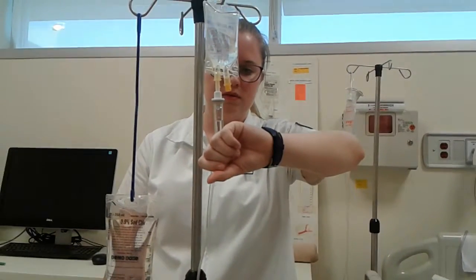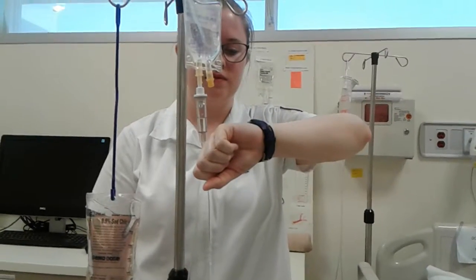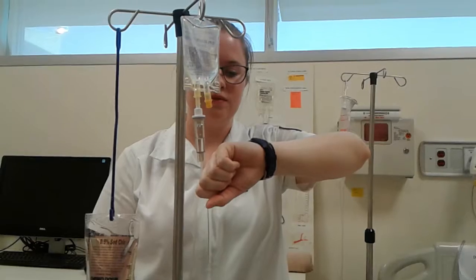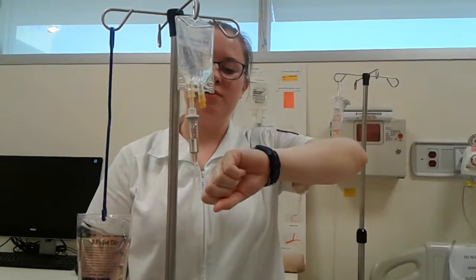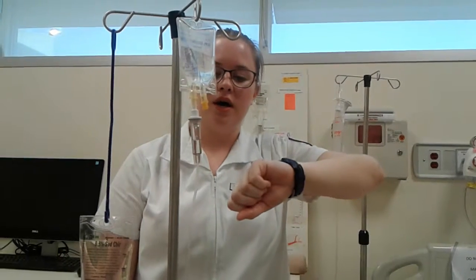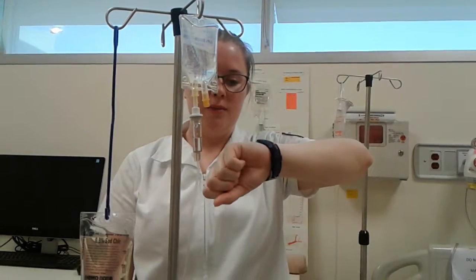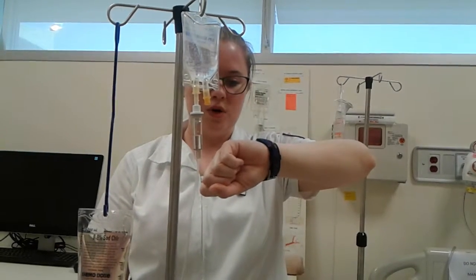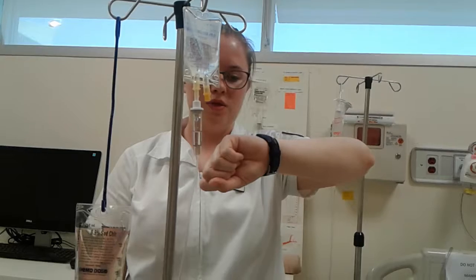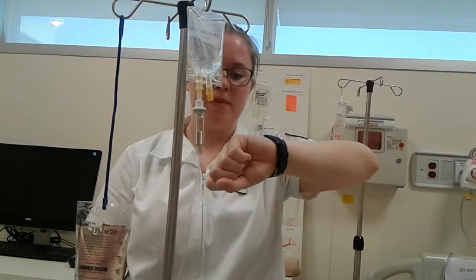And I'm going to make sure that the dressing is in place. So I have my IV piggyback solution set to the drip factor of 1 drop every 3 seconds, and I'm going to check it. 1, 2, 3, drop, 1, 2, 3, drop.